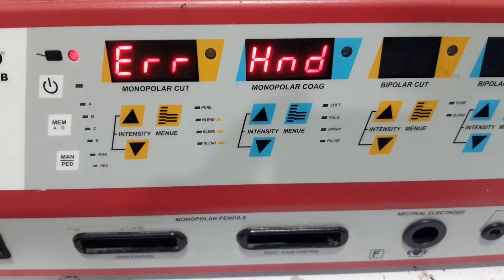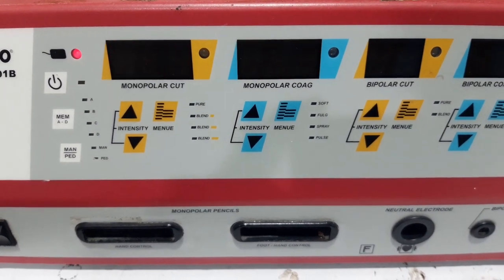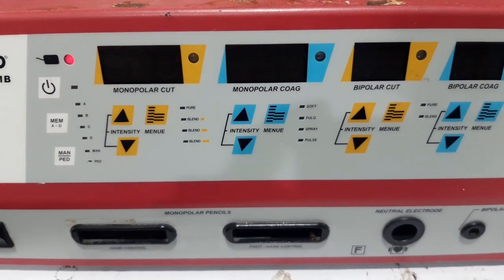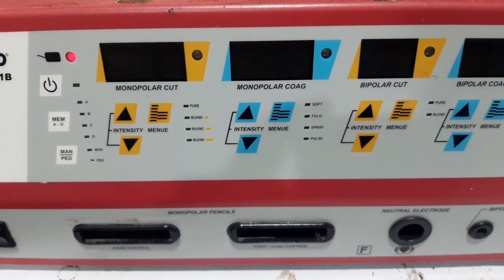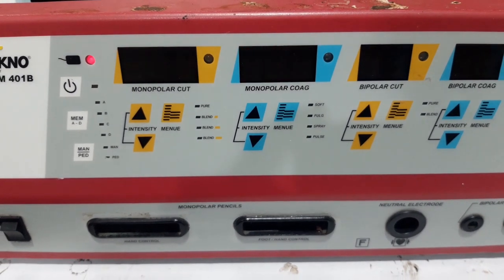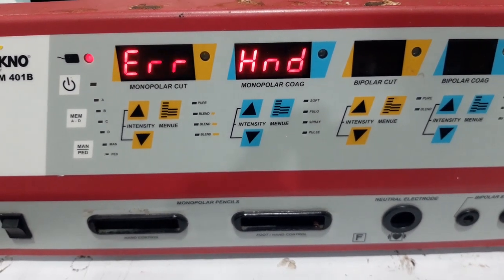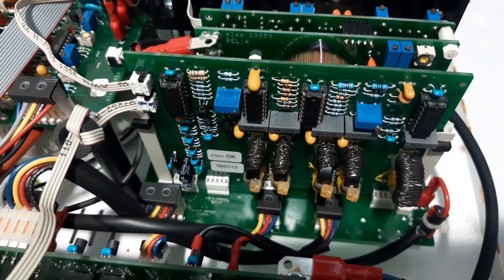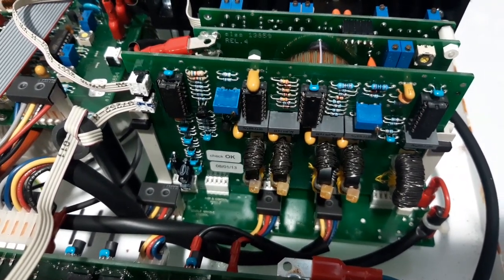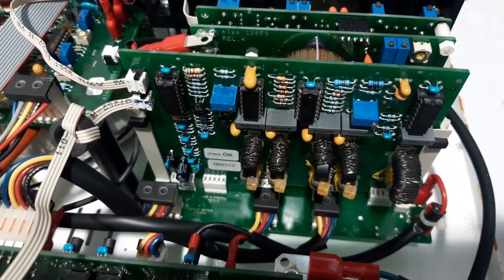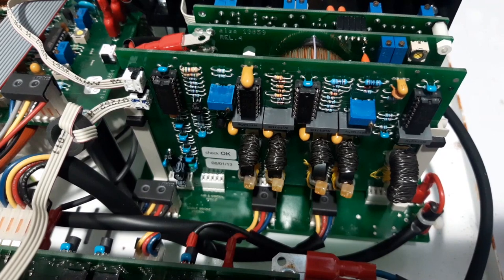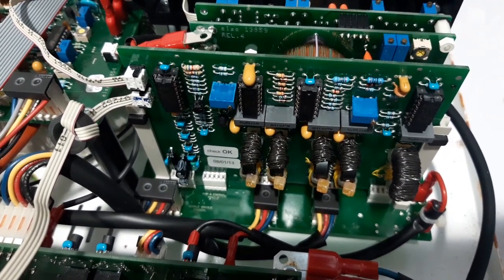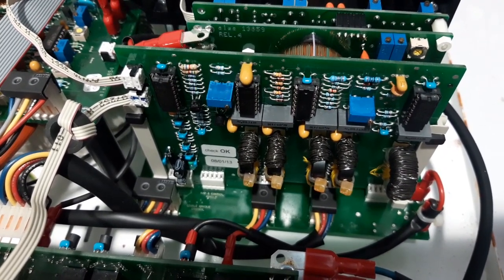I have this electrosurgical unit and it has an error as you can see. This error is related to this board, so we are going to remove this board and troubleshoot it.